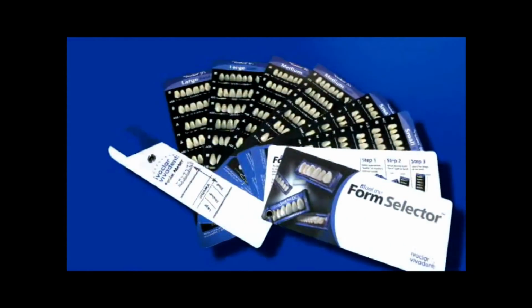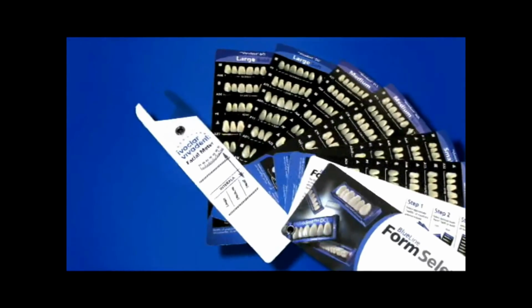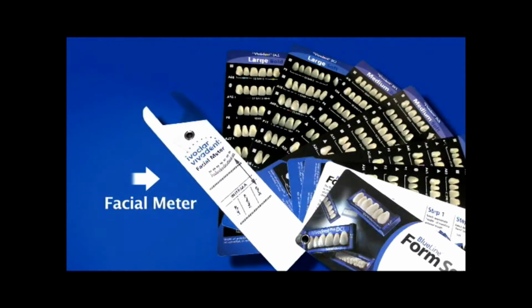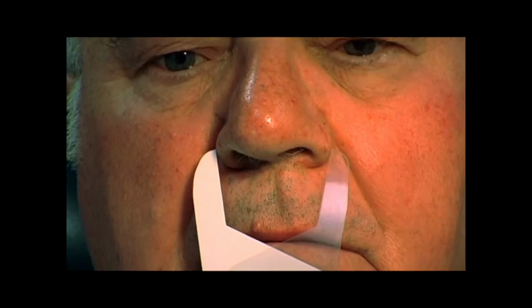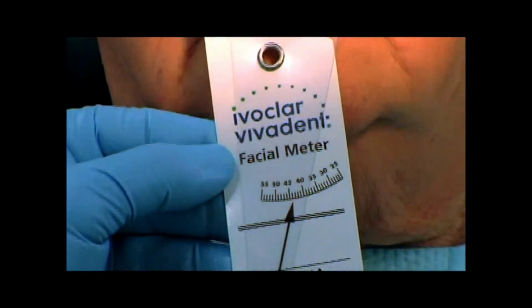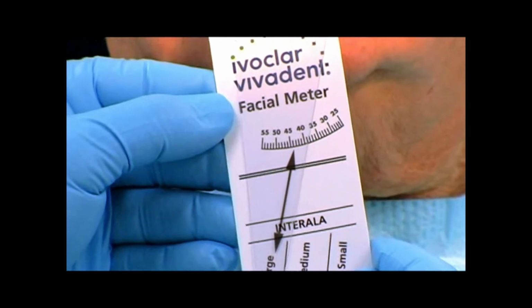The form selector is a fan-shaped device that is designed to facilitate the selection of the maxillary anterior teeth. It consists of a facial meter and a series of cards that represent all the maxillary anterior molds in actual size. The facial meter is used to determine the width of the patient's nose. The tips of the meter are carefully placed adjacent to the widest part of the patient's nose. The meter is read below to determine what size tooth would be most appropriate for this patient. In this case, it measures for a large tooth mold.